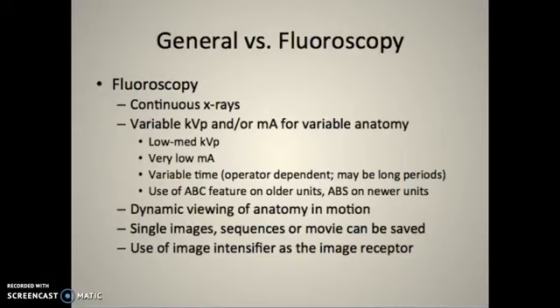The receptor that we use is called an image intensifier. You'll hear me refer to it as an II. So the image intensifier, or II.